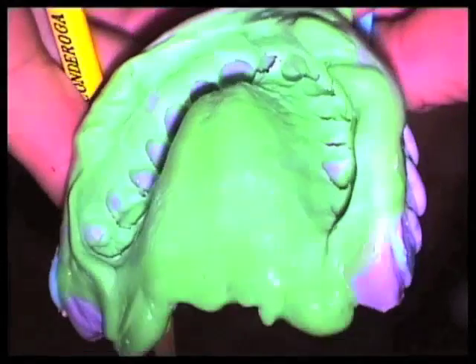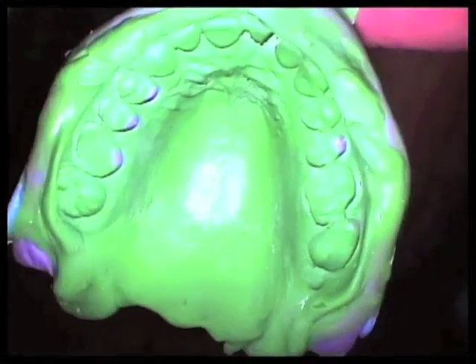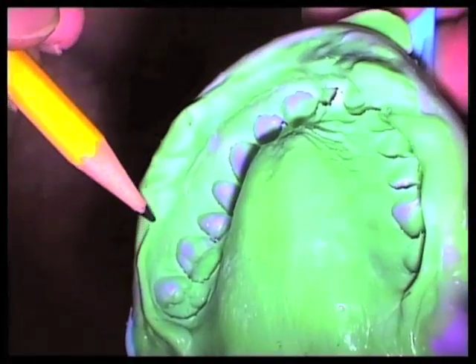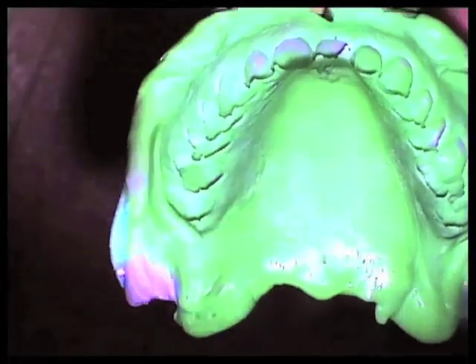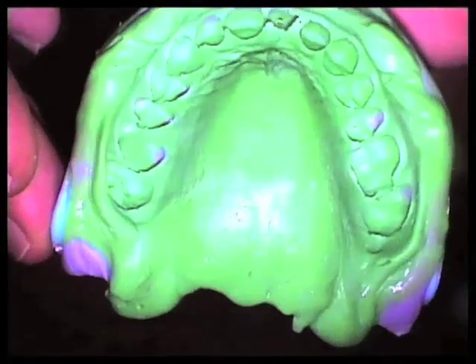All right, so when we analyze our maxillary impression, what I want to see, you can see all the way back to our hamular notches back here. I've got my border buccally well extended above our free gingival margin. I've got all the palatal tissue here. And that's really what I want to see.